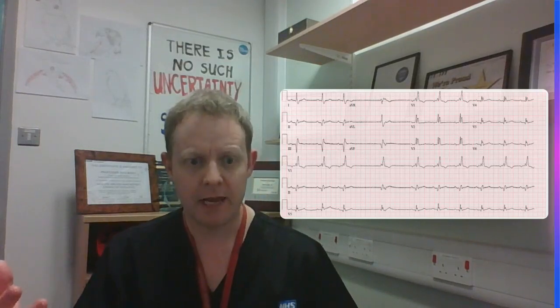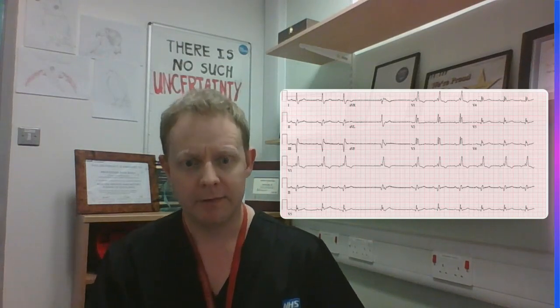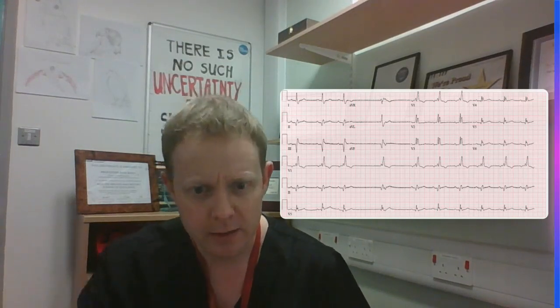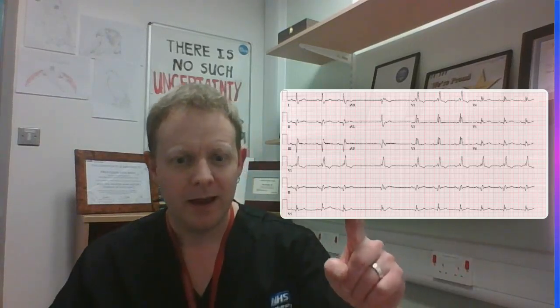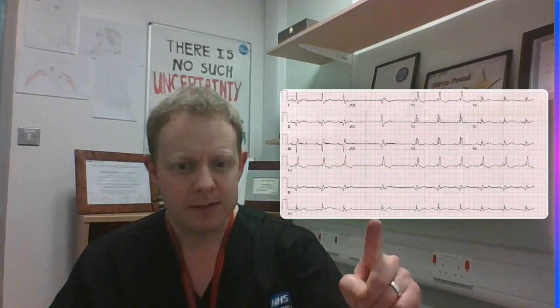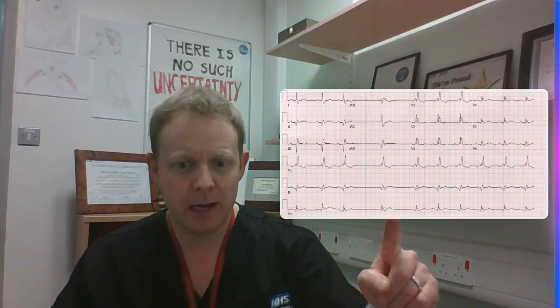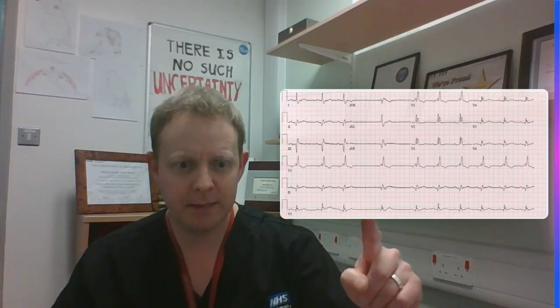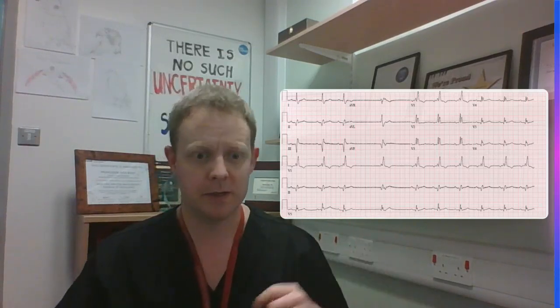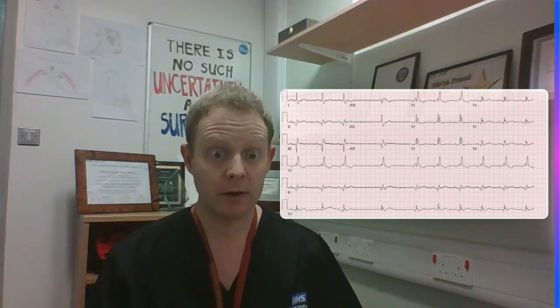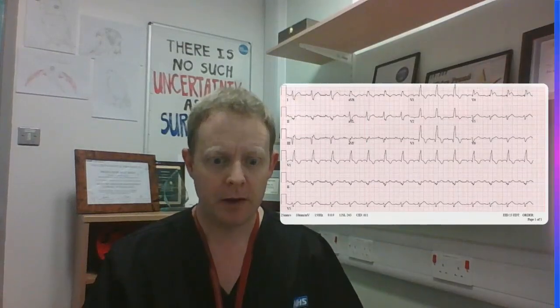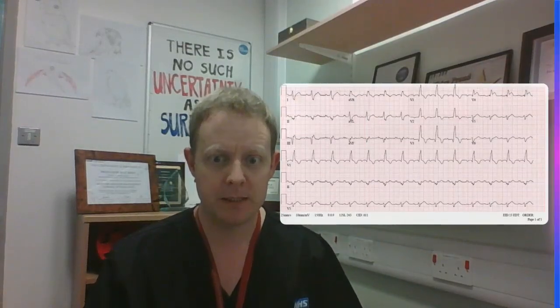We've got first degree AV block, and in fact look at this gap on the trace where there's no P wave — this looks like a junctional escape beat. So this patient does seem to have significant conduction tissue disease. Let's look at one last ECG to finesse the principle.